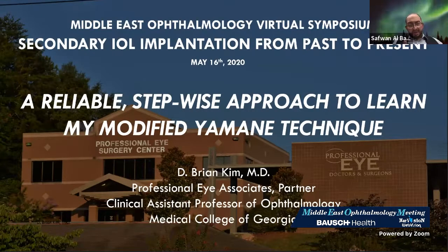Muhammad, just one comment if you don't mind. Now here we have two needles. The double needle technique is the modification Yamani did. I think with 9 by 12, the first should be 9 and the second should be 12, because 9 means any rotation will not touch.